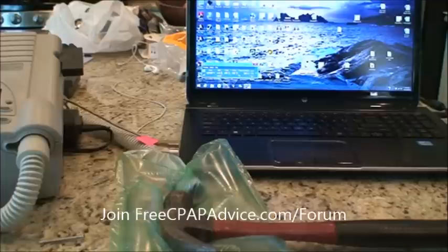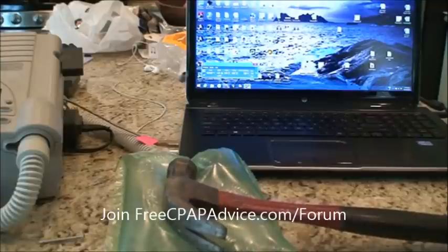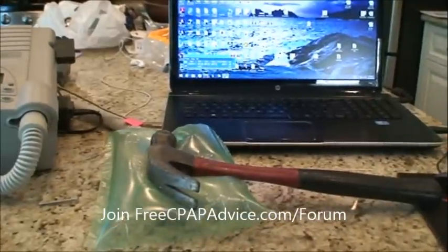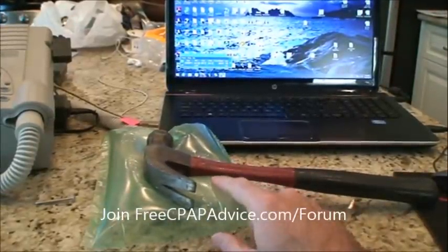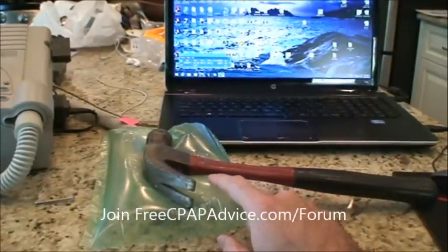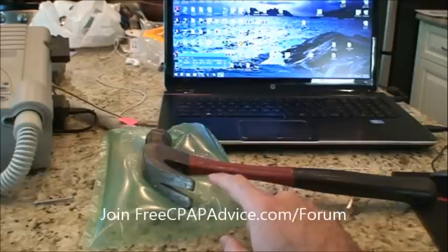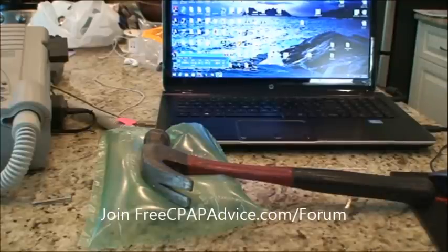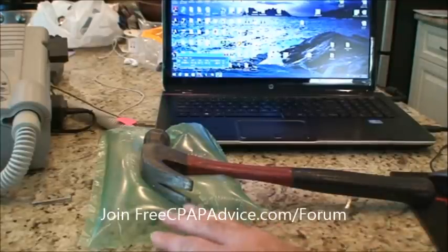So let's go ahead and increase the pressure. We're going to pretend like no CPAP is on right now, and now we're going to increase the pressure a little bit. What happened here is that when we increased the pressure, this went up a little bit. Now it's reporting the leak to be 18, and we're on 5 centimeters of water pressure. That's probably actually pretty accurate at that pressure in the lab, so maybe we have the holes on the front of the bag correct.